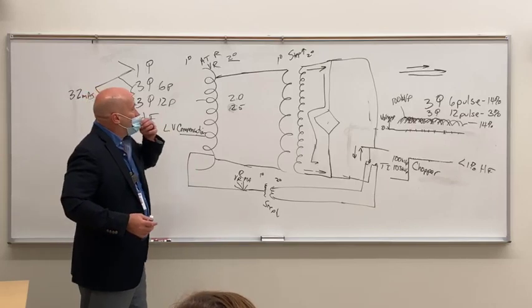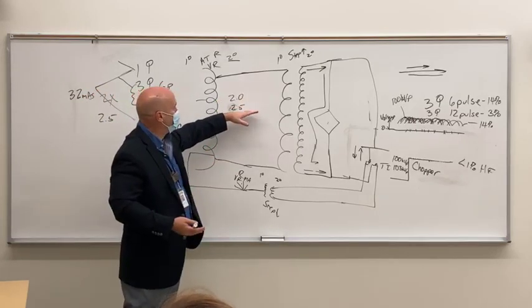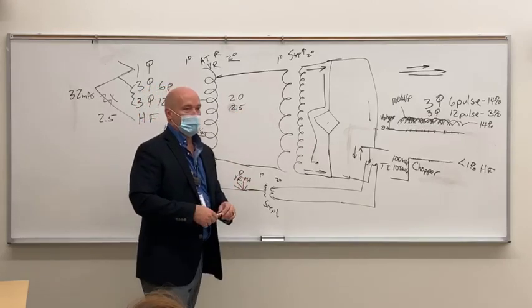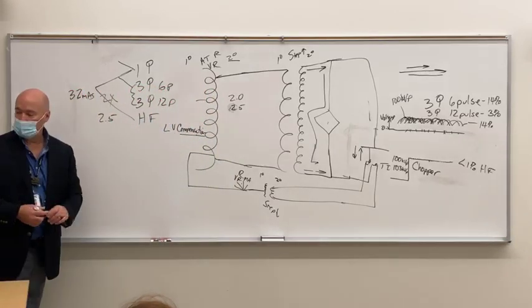Because the amount of output difference between 3-phase 6 pulse or even 3-phase 12 pulse in high frequency is only about 25%. And that's just not enough to get in a twist about it. Okay?